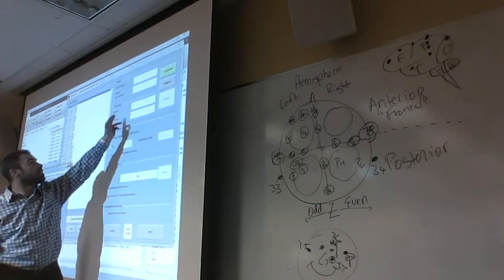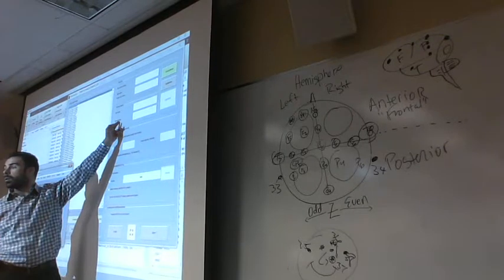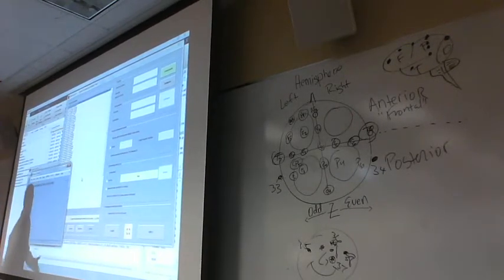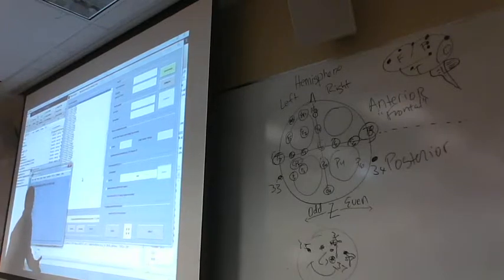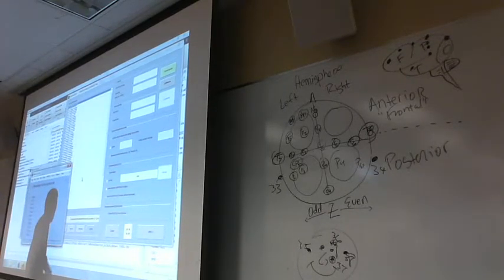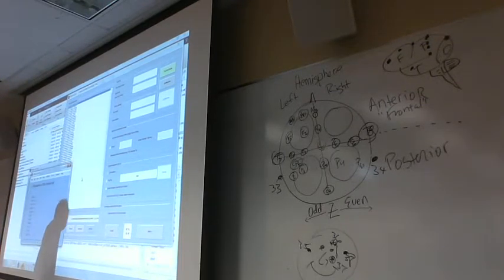You want to give it a bin description. But for bin description, let's just keep it the same as the condition label. Let's just type the same thing, AN1SL SCH. And hit the top right green button.